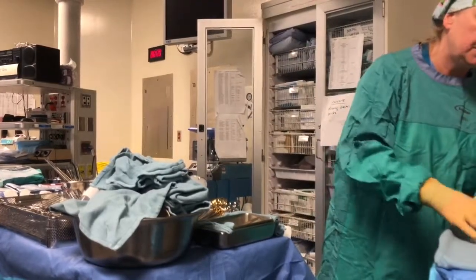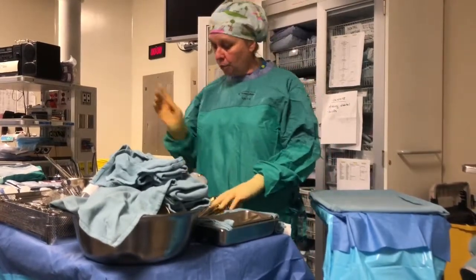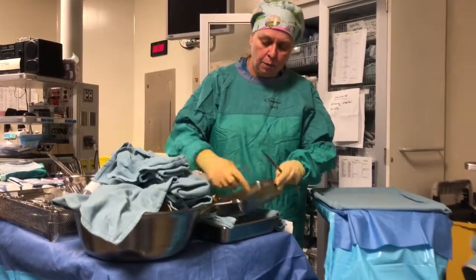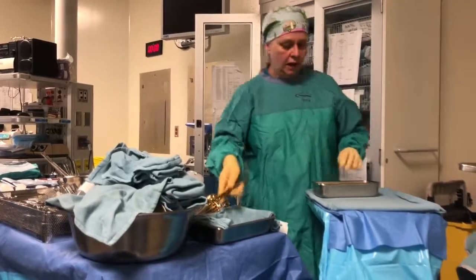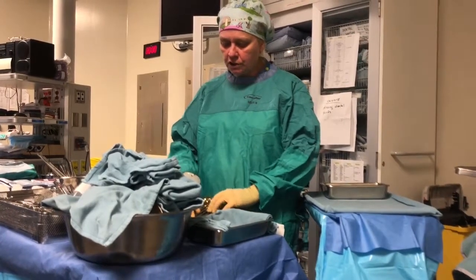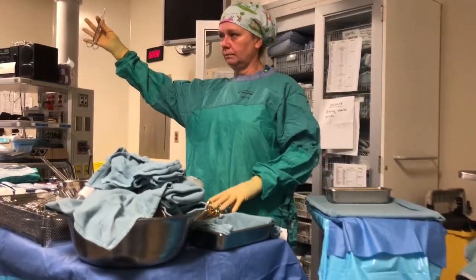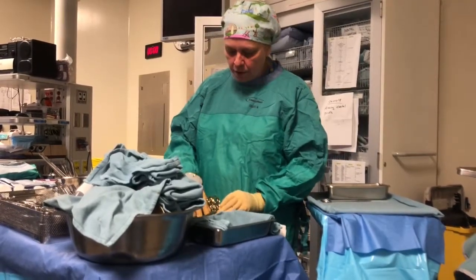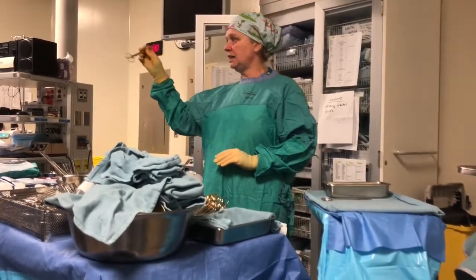We would be using a Mayo stand, okay? So on my Mayo stand, with an aorta, I would put my scalpel up. Of course, I'd have a thing in there. I'd have suture scissors for sure, because you know that you're going to use suture scissors. So those are suture scissors. Okay. Nice, heavy, like when you're talking aorta, it's a heavy thing to cut. So I'd have nice, heavy curved scissors.